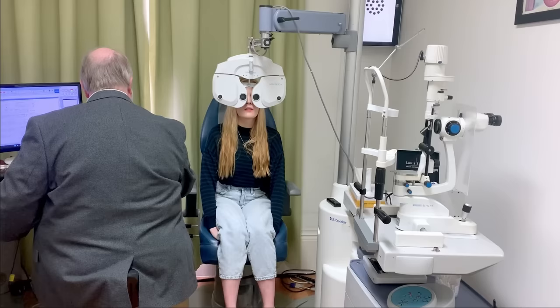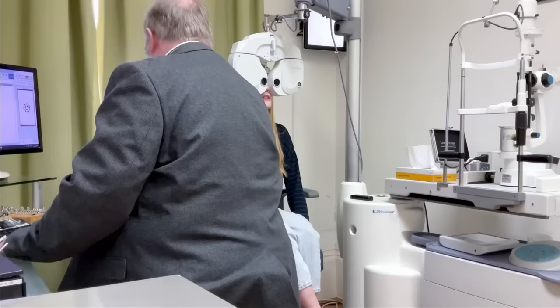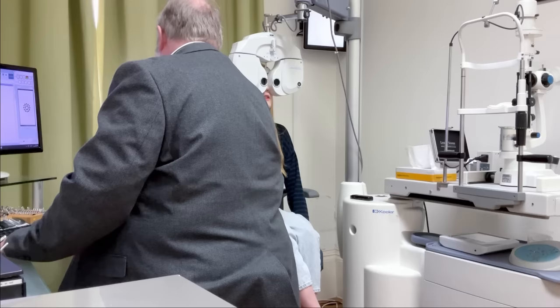This one's much better. Yeah, first one? Better than that one, is it? Yeah, it's crisper. And again, any better with the first one? The second one? First one. That one is a bit easier, yeah? And that's the first one again. Or that second one? First one. And second? First. And let's try first. Second again.